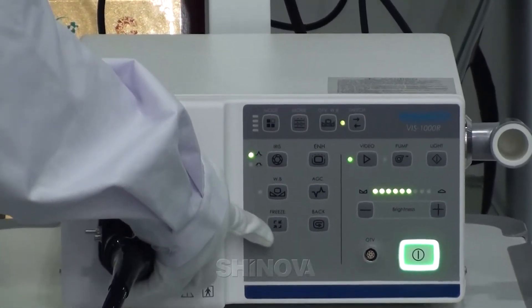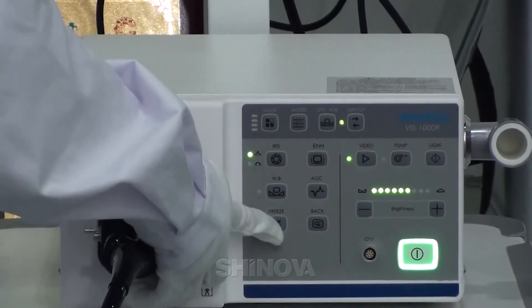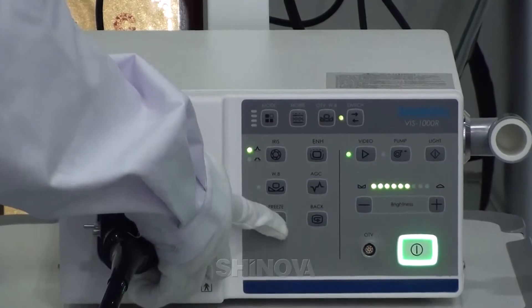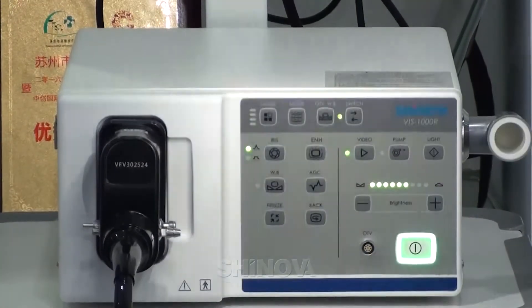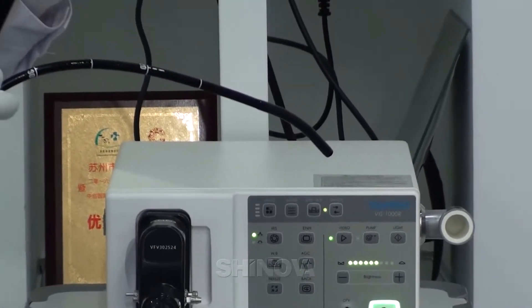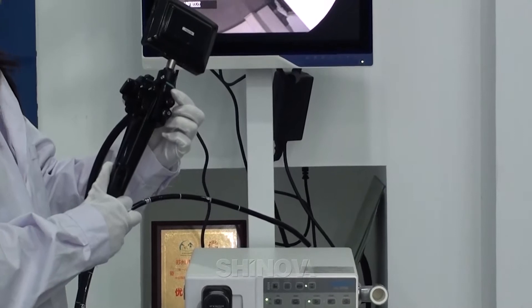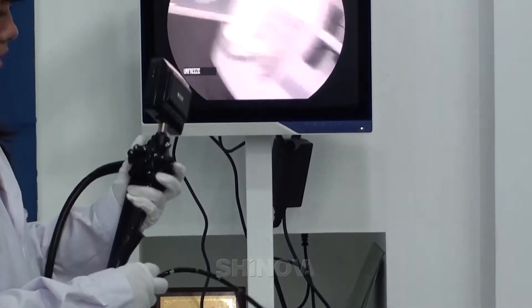Then there is the freeze press. You can freeze the picture from here, and you can also freeze the picture from your control body. Press it and it freezes. Press it again and it is free.